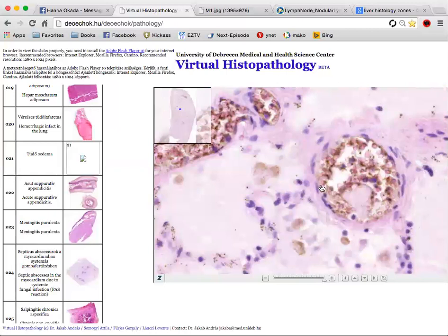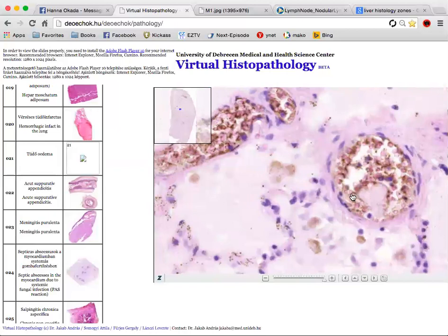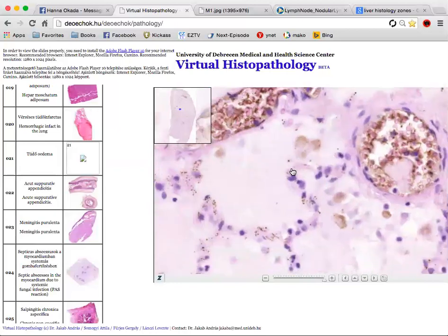You see it congested in the blood vessels, and this creates pressure. It creates a hydrostatic pressure and moves fluids out of the blood vessels. There are little capillaries all in the alveolar septa, and it pushes this plasma inside the spaces. So edema is induced by left heart failure. Yeah.